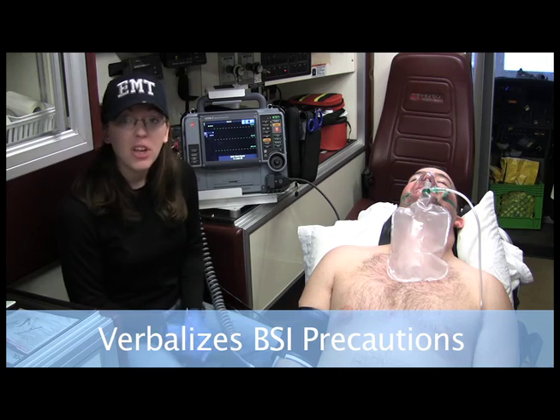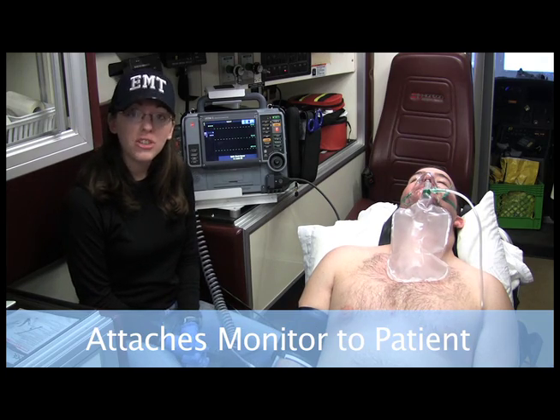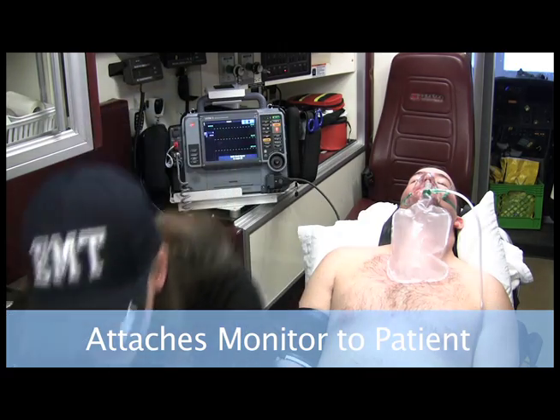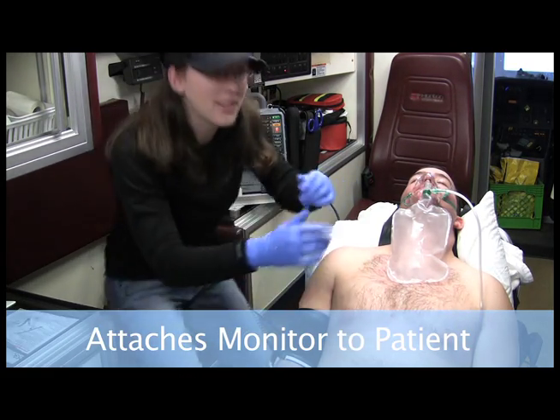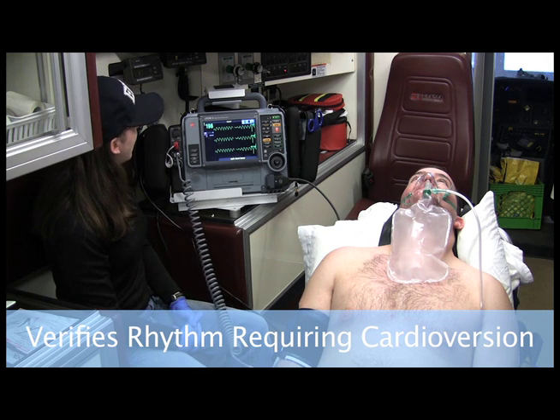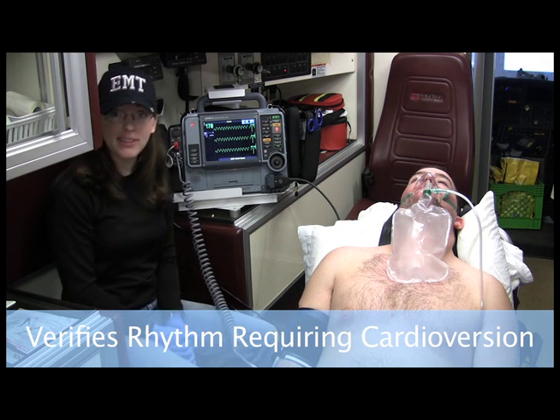I got my BSI on. So now I want to attach the patient to the monitor. I have four limb leads, so I'll attach the four limb leads. I'm looking at the monitor and I am seeing a wide complex tachycardia.